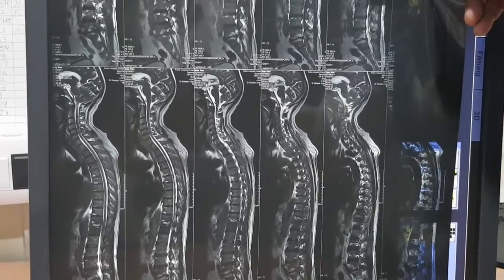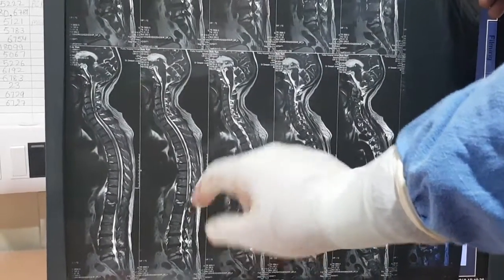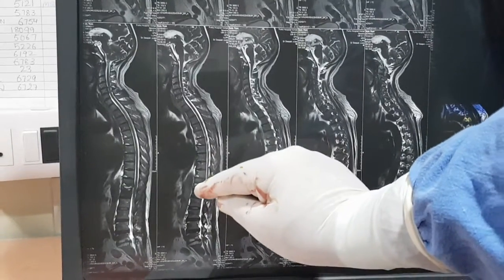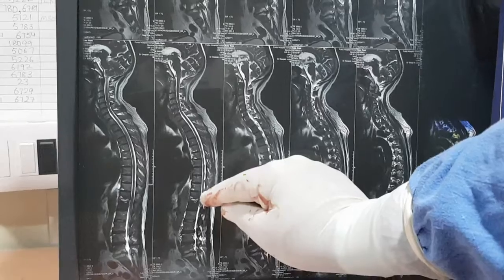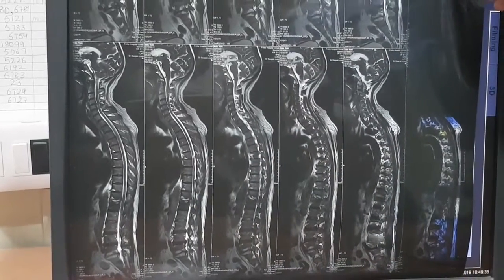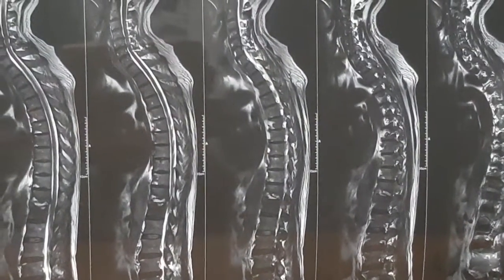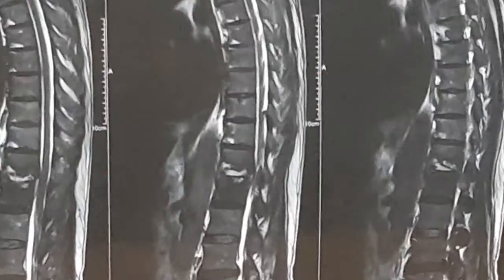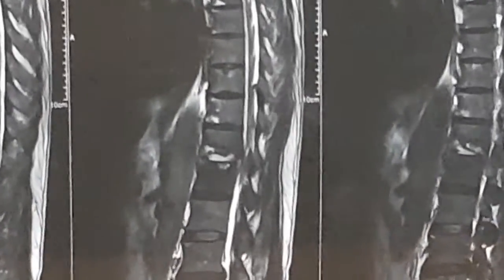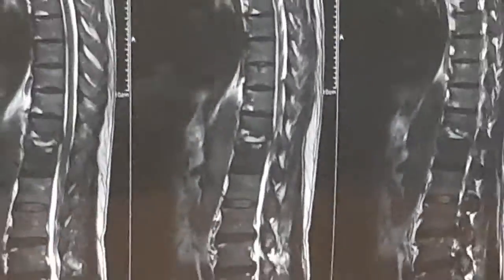This is a patient with very severe pain. Focus on this much — we have a very intense D11-D12 disc here, enlarged. This disc is hyperintense in the middle. I have four more discs: this one, this one, this one, this one. The body is also bright. So we have this hyperintense disc and very severe pain.